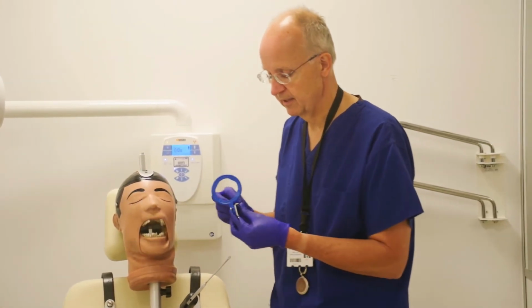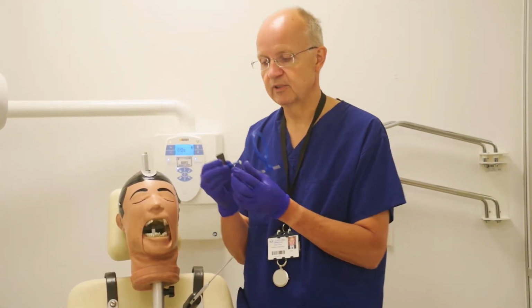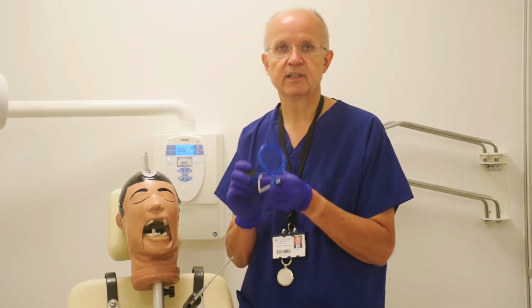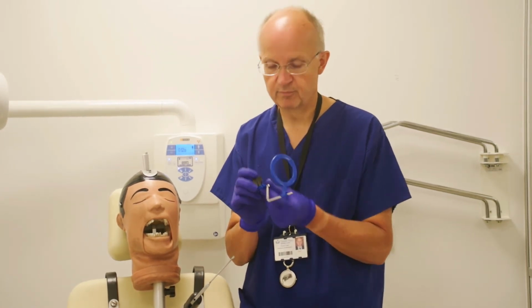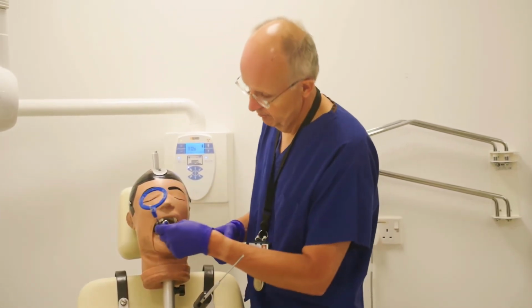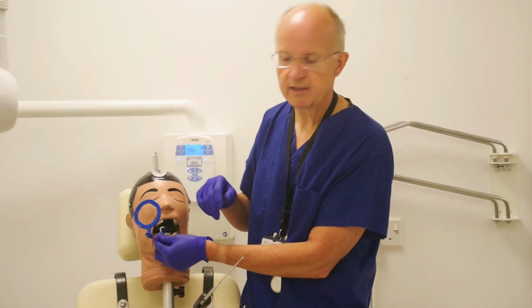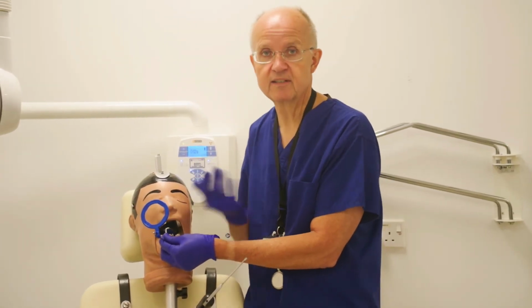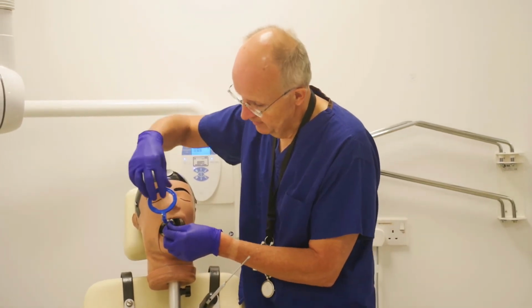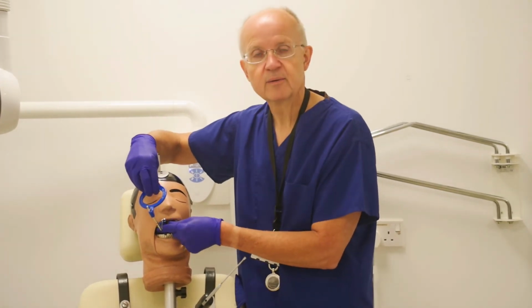Now, one important thing to remember is that we're placing this holder into the mouth where we want it to be, and we're asking the patient to bite down to hold it where we've put it. Now, I see no end of people just popping these into the mouth, holding it somewhere around roughly the right area, and then asking the patient to bite, as if the patient knows where it's going to go. So the important thing to do is to place that bite guide against the tooth we're going to x-ray, so against the crown there.